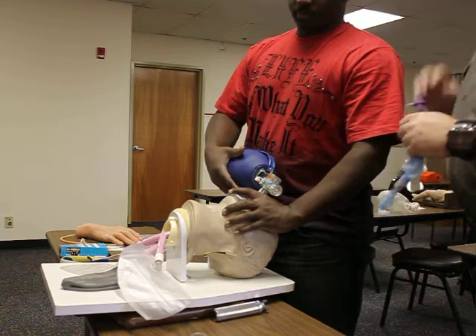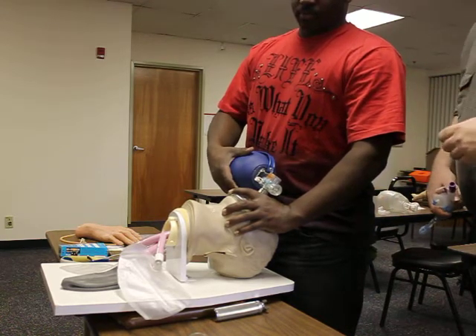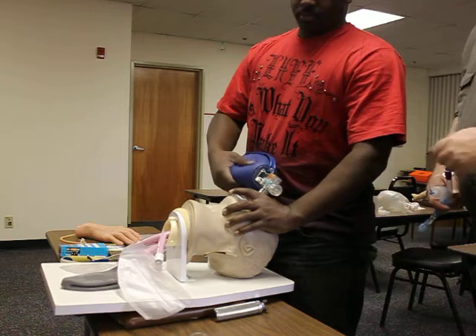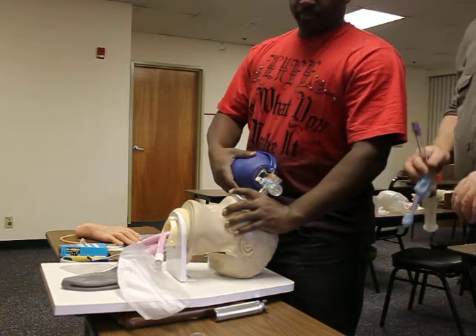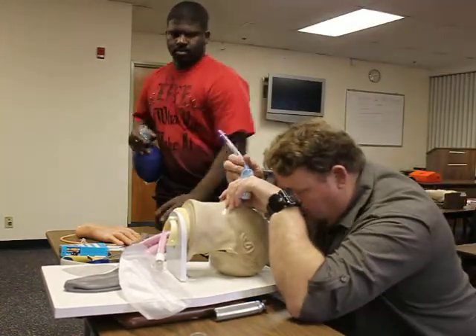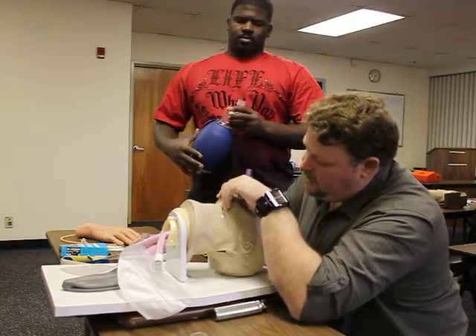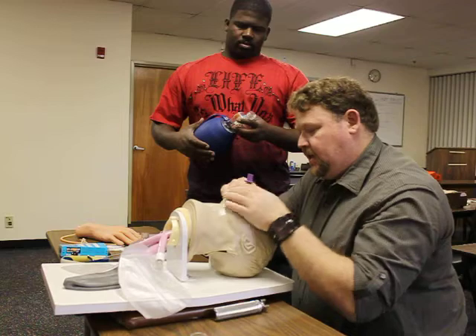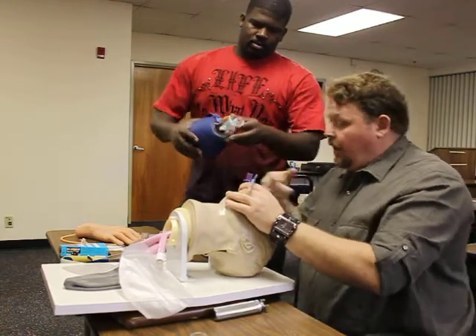Solomon, on three please — we're going to go ahead and remove the BVM, remove the OPA, and then take the mask off the BVM. One, two, three. I'm going to perform a tongue-jaw lift and insert my King Airway. I'm resting right about the 14th mark. I'll inflate my cuffs. Go ahead and ventilate, please.